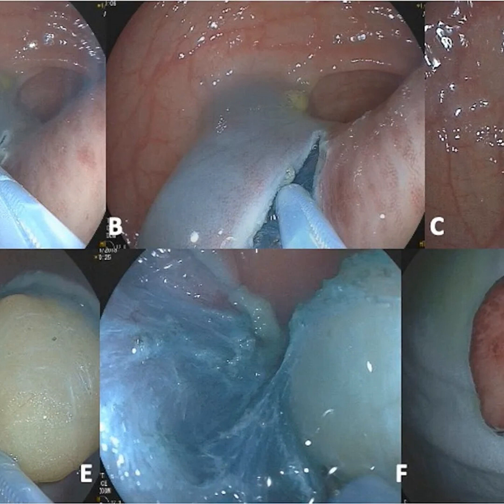Lateral and deep margins can be thoroughly assessed to confirm complete removal. This hybrid approach is useful for laterally spreading colorectal polyps, where the pre-cut groove enables en-block lateral margin resection, decreasing recurrence compared to piecemeal EMR. Large, flat adenomas that cannot be resected fully with standard EMR benefit from pre-cutting to facilitate en-block removal. Slippery serrated polyps that evade snare capture can be completely resected via the groove. And small subepithelial tumors like lipomas, where the combined ESD-EMR technique enables resection of larger growths.